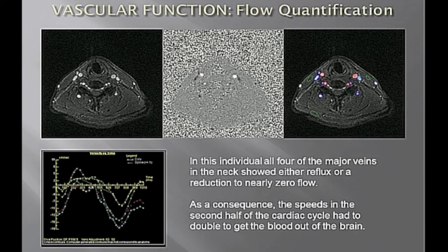And luckily that is realistically true. We can do this, and we've done it for 25 years. So I'm getting an image here roughly every 40 milliseconds. Every time I take this picture, I get another picture that shows me the blood flow through here, often parabolic on the carotid side. And then we can do the area measurements, calculate the average speed in there, and by taking the product of the average speed times the area, we have the flow through that vessel.